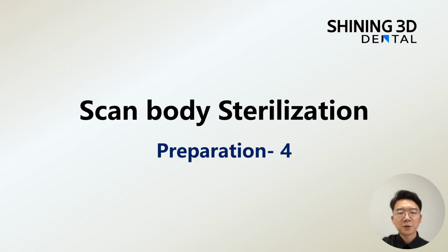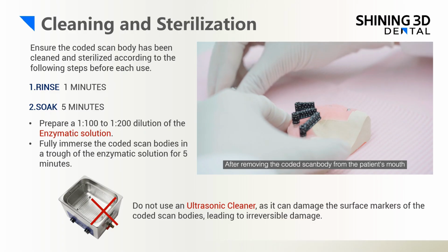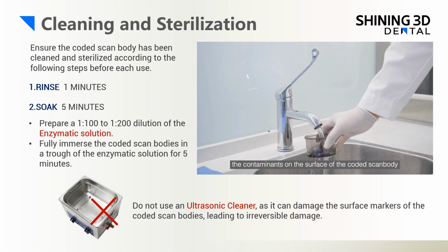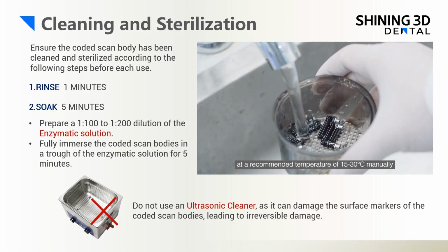Here is the final part of the preparation stage, the scan body sterilization. About the cleaning and the sterilization of the coded scan bodies, you should ensure the coded scan bodies have been cleaned and sterilized properly according to the following steps before each use.